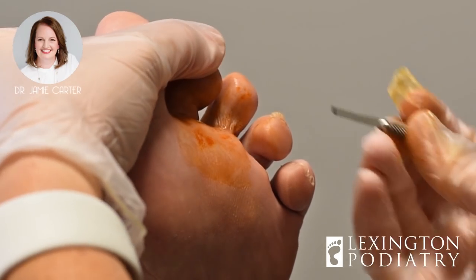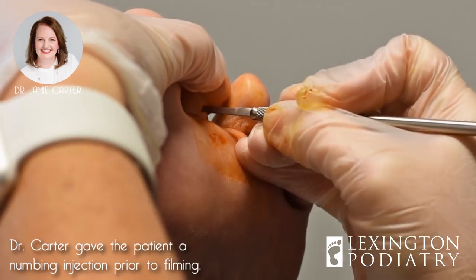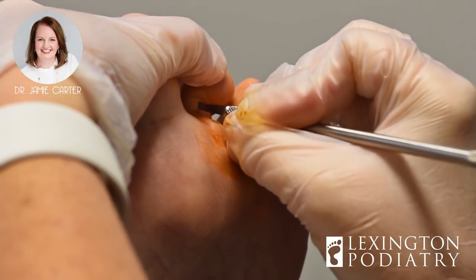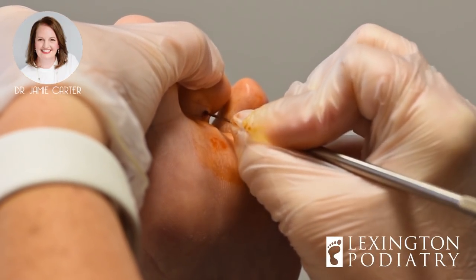All right, let's test you and see if you're numb, just to make sure I did my job. Anything there? No? Perfect. All right, straight in, turn the blade at a 90 degree angle — I can feel the tendon.